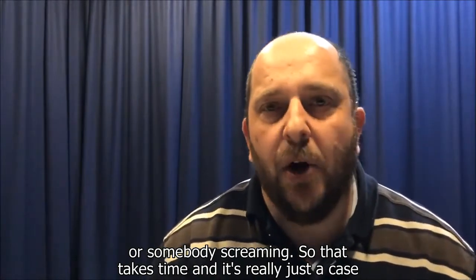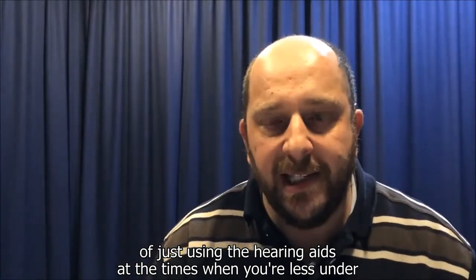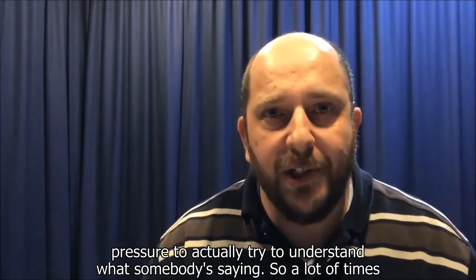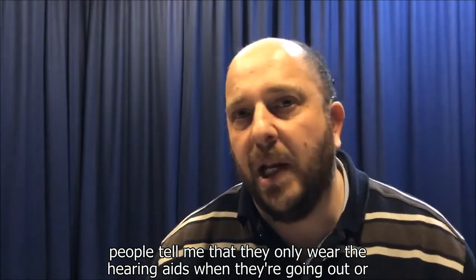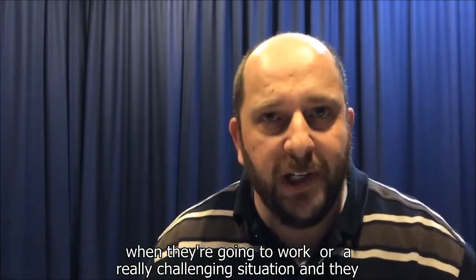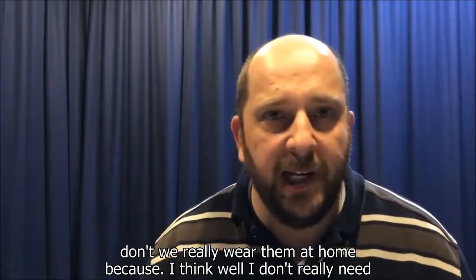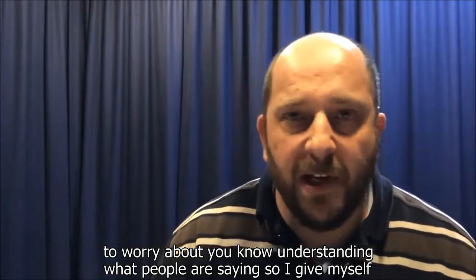So that takes time, and it's really just a case of using the hearing aids at the times when you're less under pressure to actually try to understand what somebody's saying. A lot of times people tell me that they only wear their hearing aids when they're going out or going to work in those really challenging situations, and they don't really wear them at home because they think, well, I don't really need to worry about understanding what people are saying, so I give myself a break.